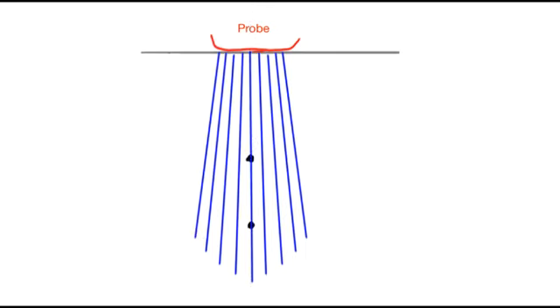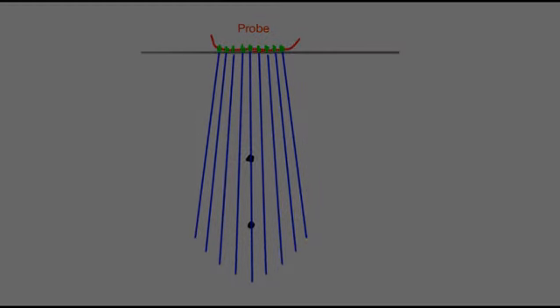And that's what you do. And so there are these little piezoelectric pressure objects, transducers they're called, in the probe, many of them. And you can electronically control them, scan back and forth, and get these different lines that will give you an image. And then that's the one dimension. And the other dimension, you can move the probe back and forth. Or sometimes you can do it electronically as well. Okay, so maybe I told you how an ultrasound image is made.